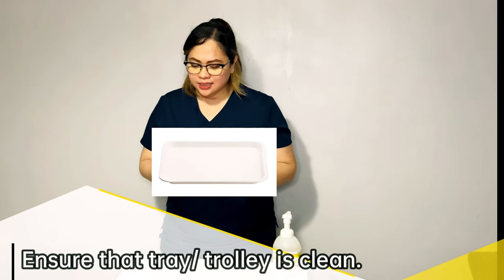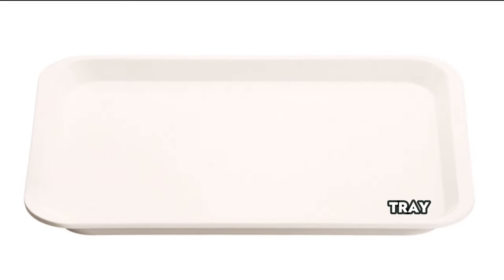So, Miss Examiner, is this tray disposable? Yes. So, I'm gonna use this one. The tray?